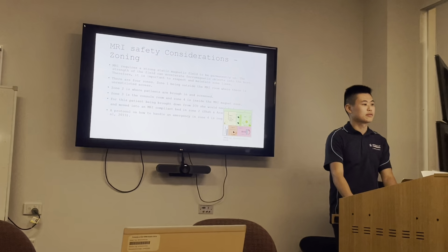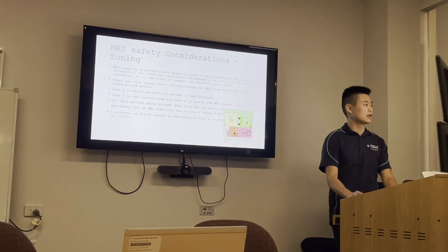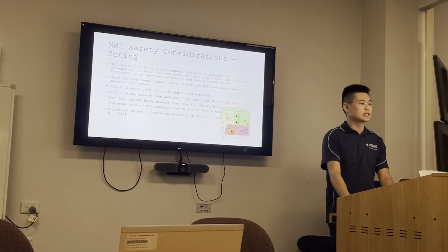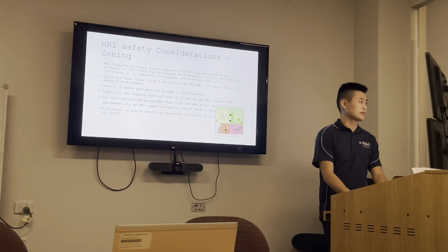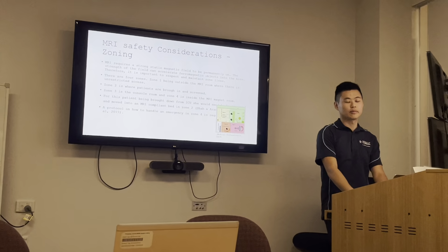Zone 1 being outside the room, where it's unrestricted, for people just walking by. Zone 2 is where the patient is brought in to be screened. Zone 3 is a console room, and Zone 4 is inside the MRI magnet room.